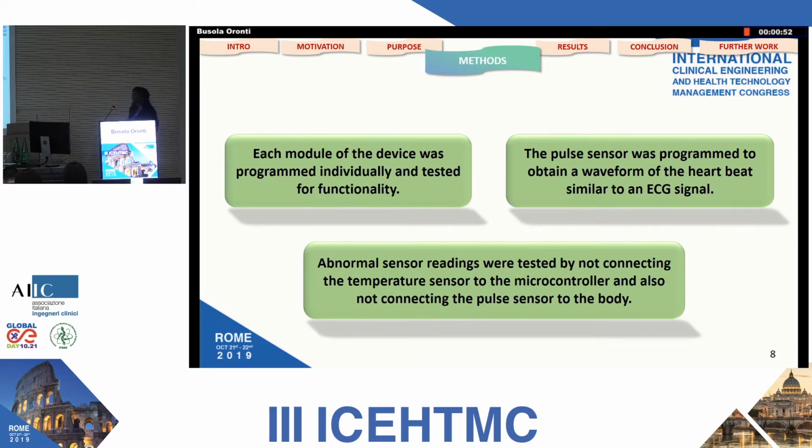Now, when we were in the process of the design, there were some processes we had to go through. We considered each module of the device, and each module was programmed individually and tested for functionality. The pulse sensor was programmed to obtain a waveform similar to that of an ECG signal.